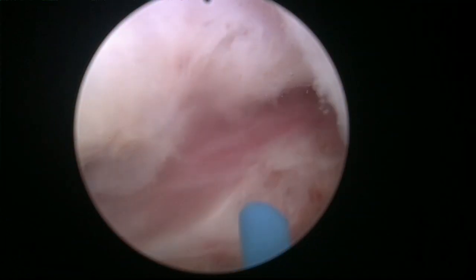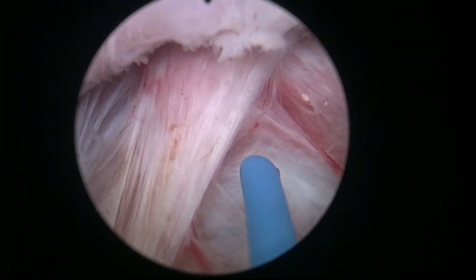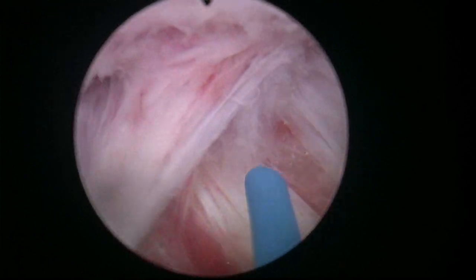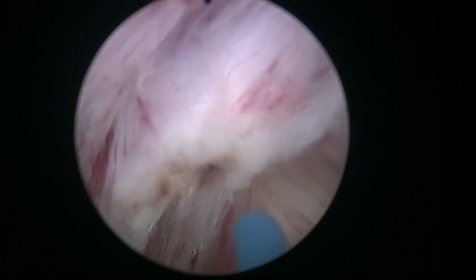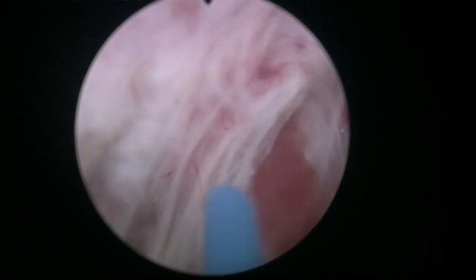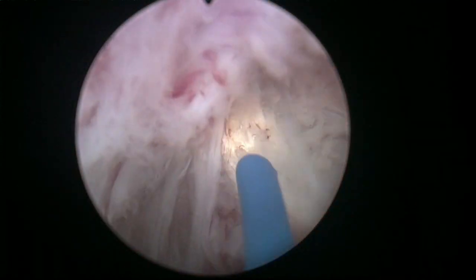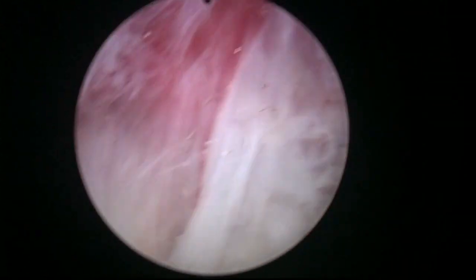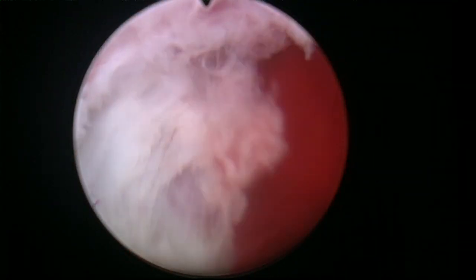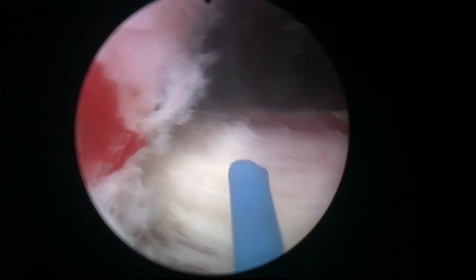Okay. See what happens if we lift. I'm going to put my scope under the lobe and try to lift it a little bit. Mechanically, you can do some harm as well, so you have to be careful. I wanted to lift the adenoma to see if I could push it into the bladder, but now I have a better view of the attachment at 6 o'clock.